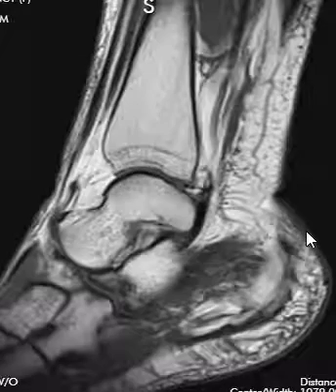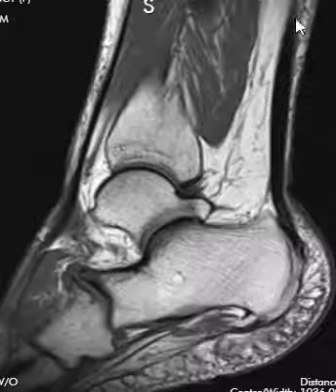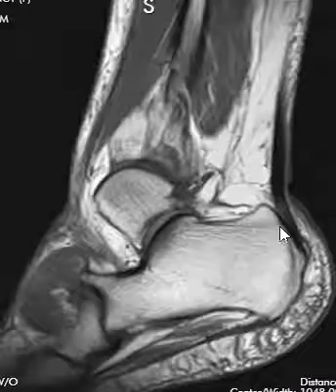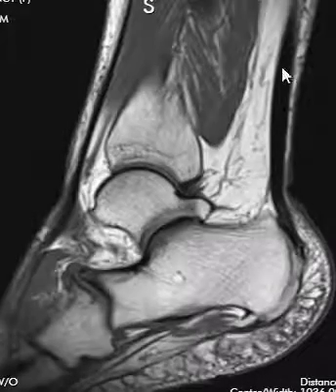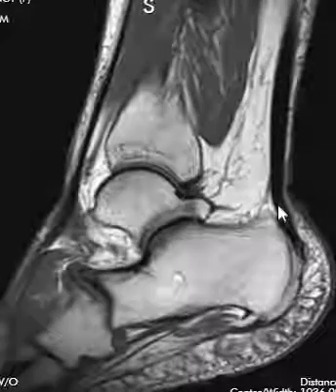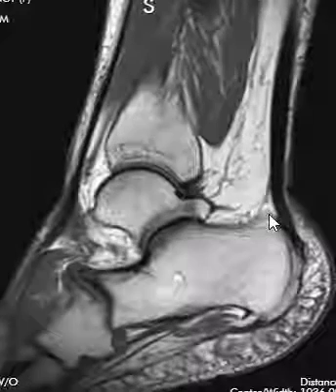First, we start with a side view called a sagittal view, and we look at something in the back here. This long, thick, dark thing is the Achilles tendon. We see it coming down — the calf muscles end — and then we see a black tendon coming down to the back of this bone, the heel bone or the calcaneus. We check whether the patient has a tear of the Achilles tendon, tendinopathy, whether it's too thick and irregular, or if they have fluid behind it called retrocalcaneal bursitis.